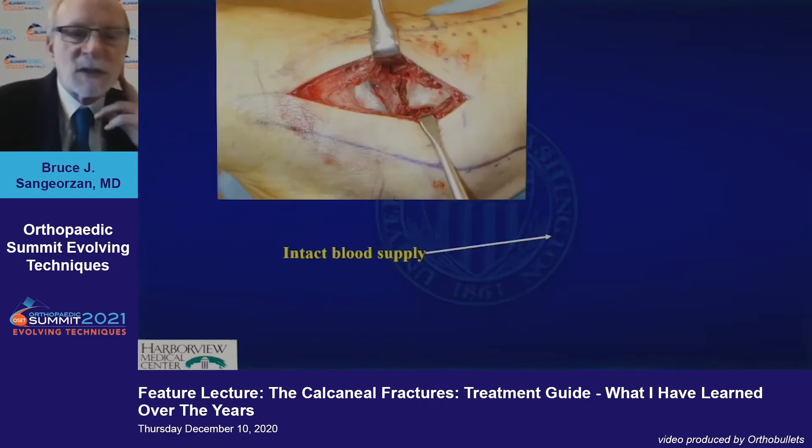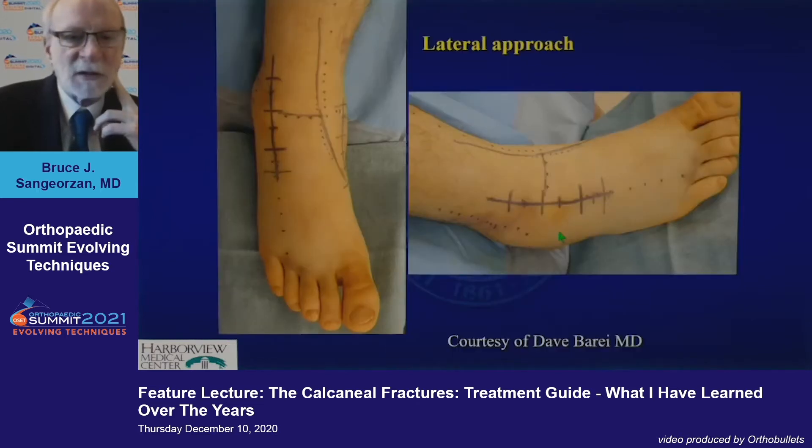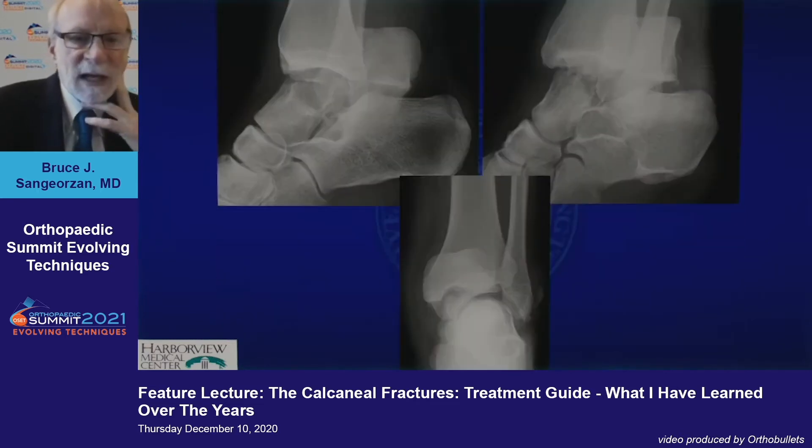This is what those incisions look like on a real live human. When you are making this approach, be very cautious. The blood supply to the talus neck is running right up here. Keep your retractor right over the fracture. Stay away from that dorsal neck. This is the lateral approach.